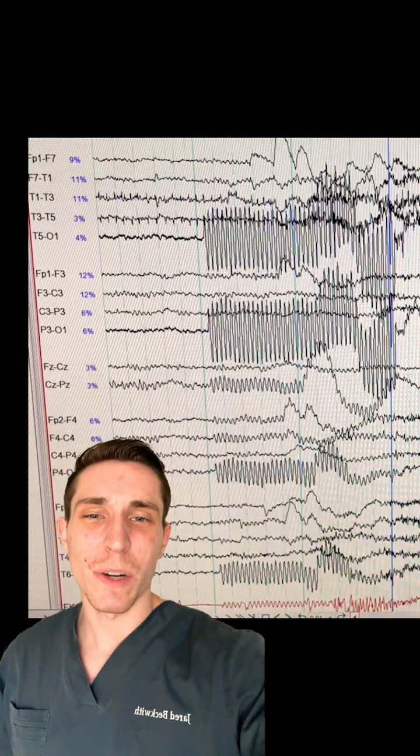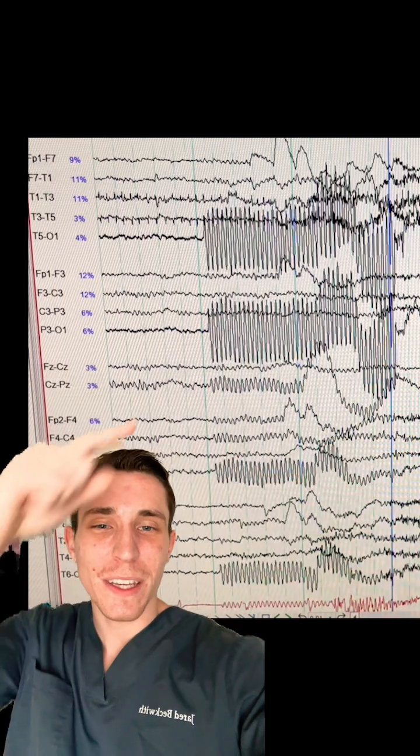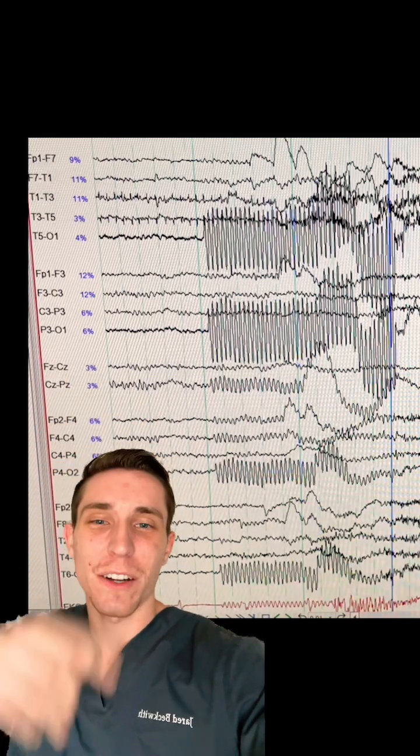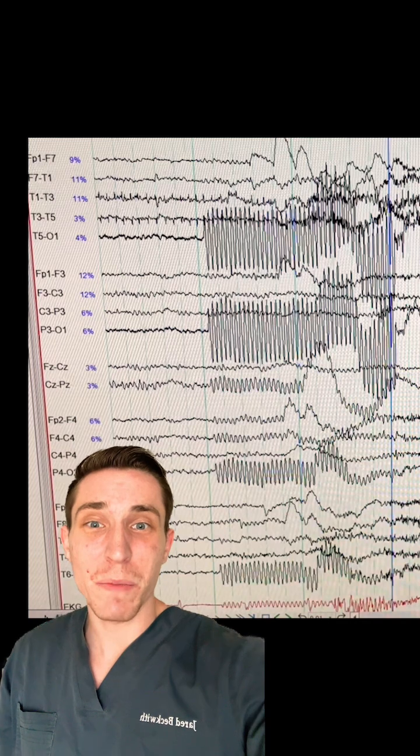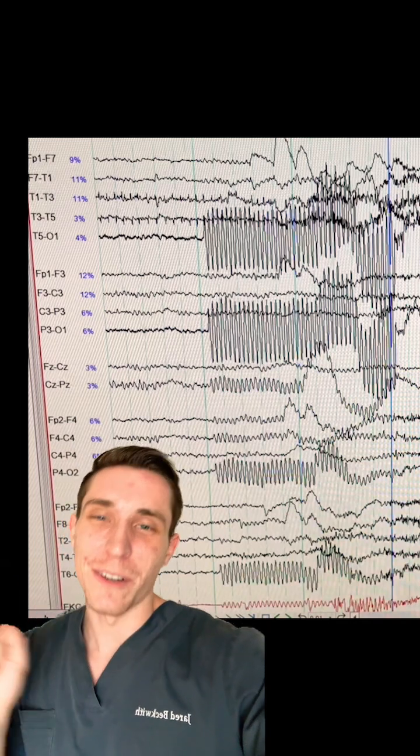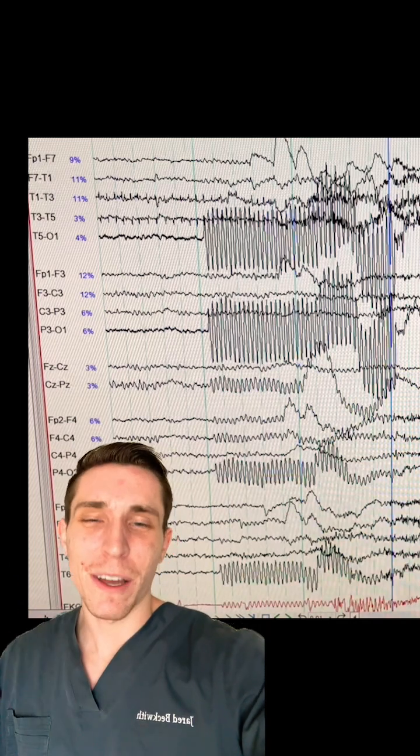So when I saw this rhythmic activity coming out of nowhere, when you see something rhythmic, you think, oh, seizure. But no, guys.